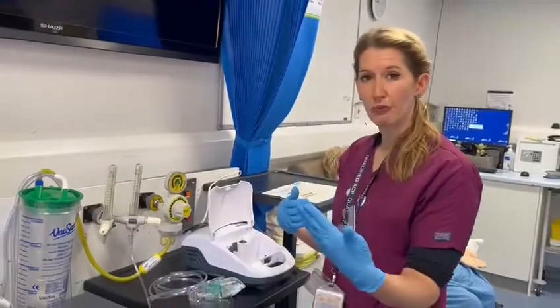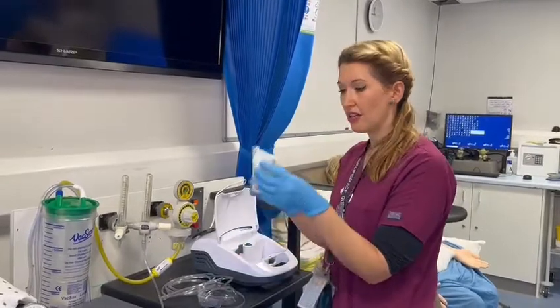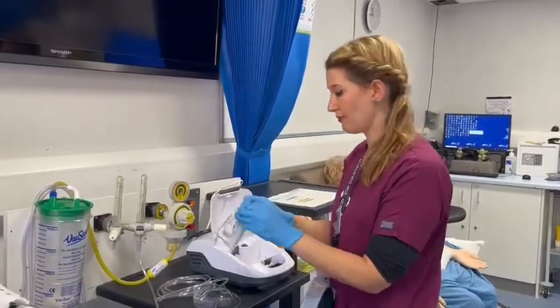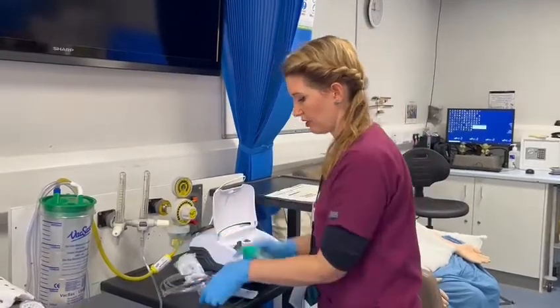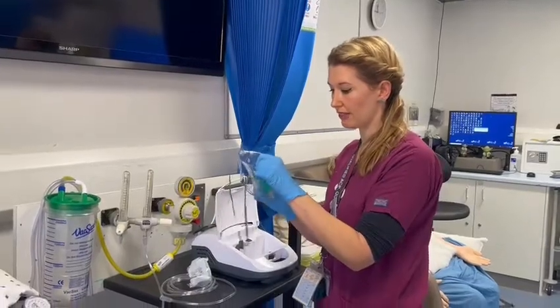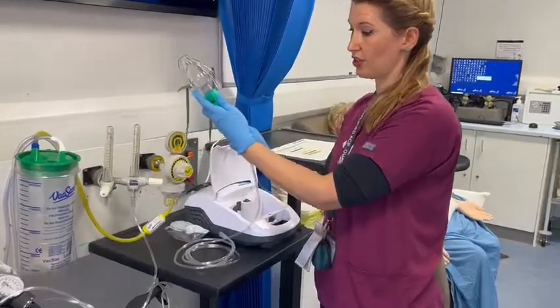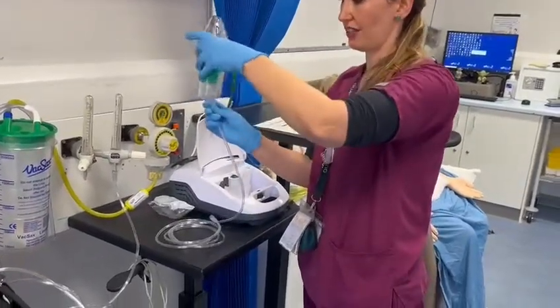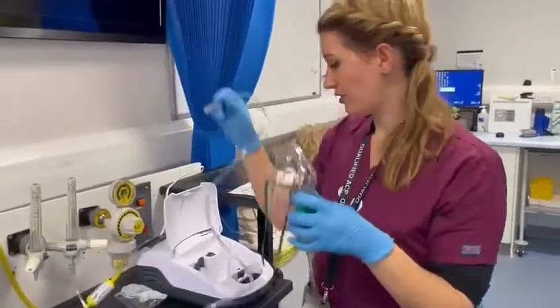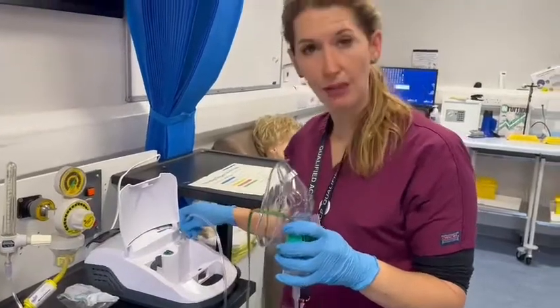So obviously you've looked at your prescription and seen what kind of drug you need to deliver. You get the drug ready and your devices ready. I'm going to open up my nebuliser chamber, connect it to my mask, and then connect the end of the oxygen tubing to the end of the nebuliser chamber. I would then use the port on the end to connect it to the port on the nebuliser machine.